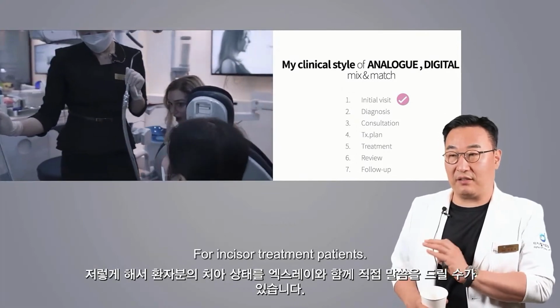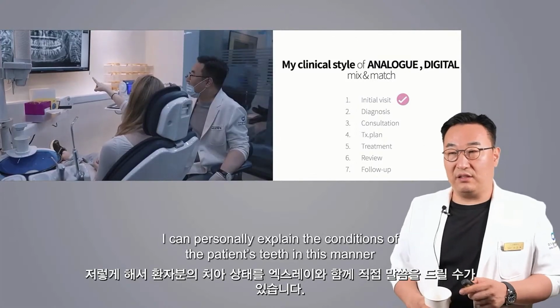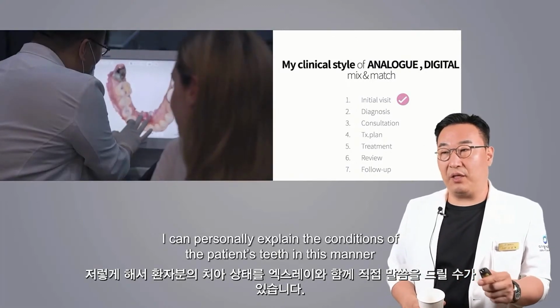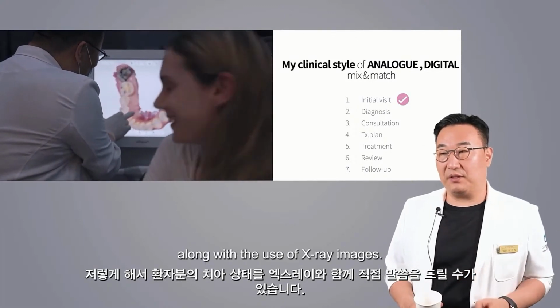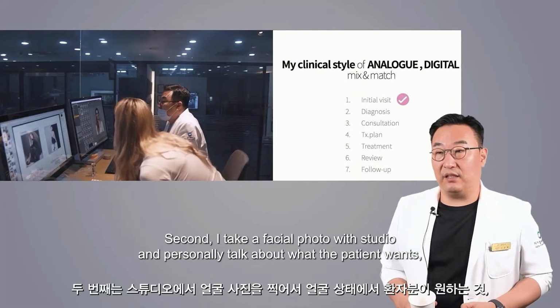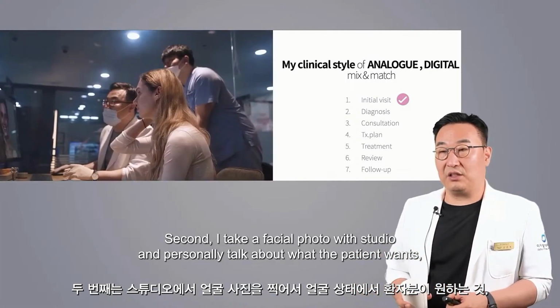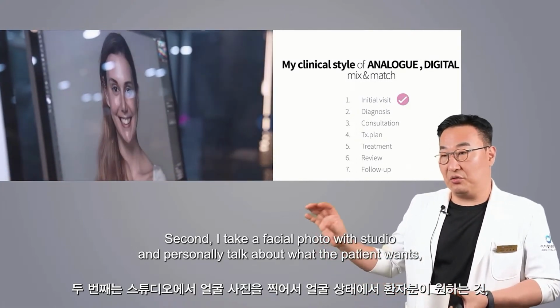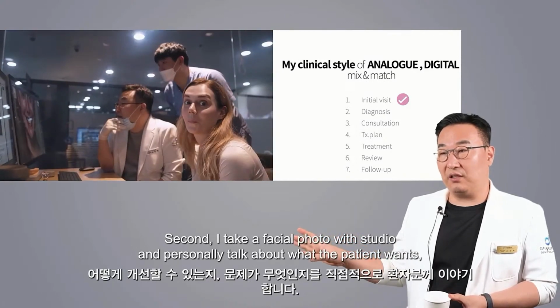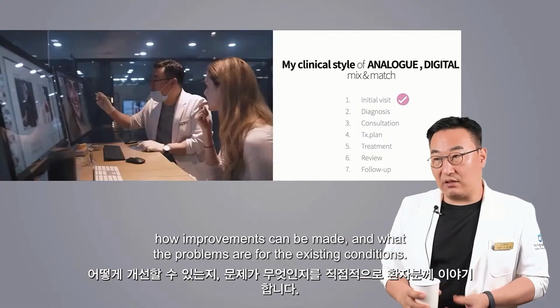For incisor treatment patients, I can personally explain the conditions of the patient's teeth in this manner, along with the use of X-ray images. Second, I take a facial photo with Studio and personally talk about what the patient wants, how improvements can be made, and what the problems are for the existing conditions.